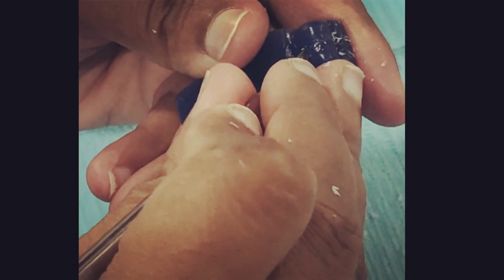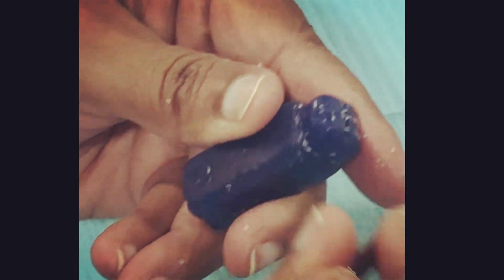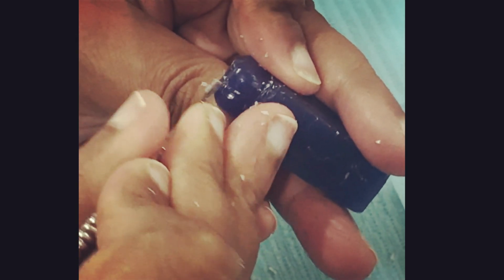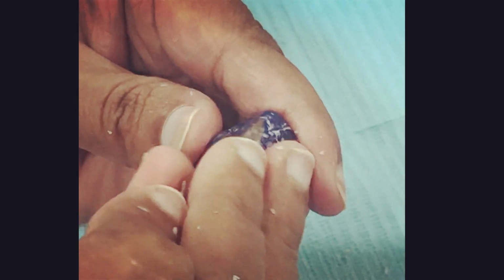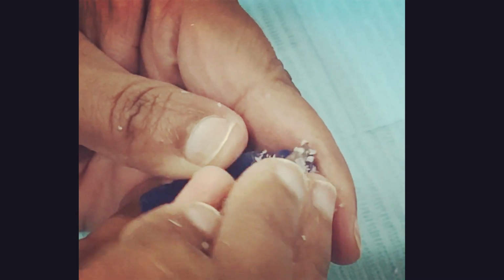Okay, so we created that concavity, and then right next to that just try to carve it like this. Okay, so this is to create the shape of the cusp, and the same here from this side. So you're creating small ridges, yeah. Okay?